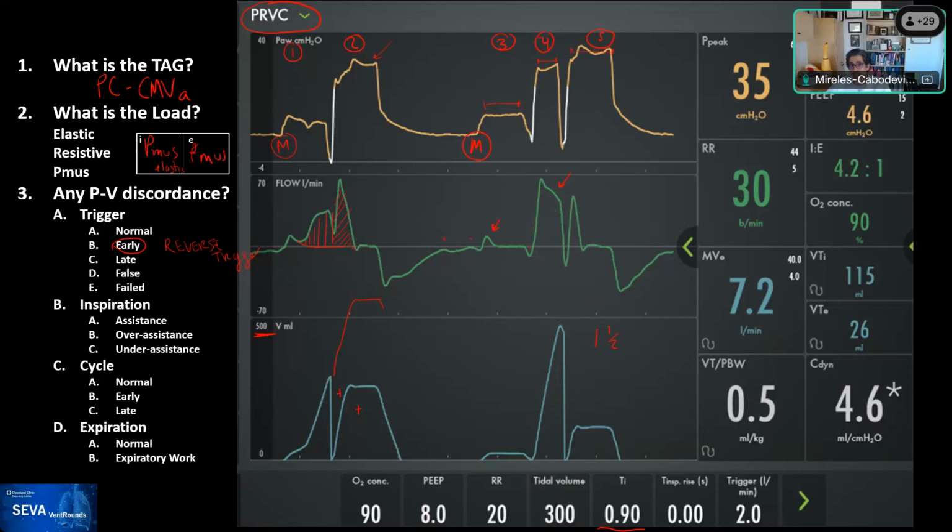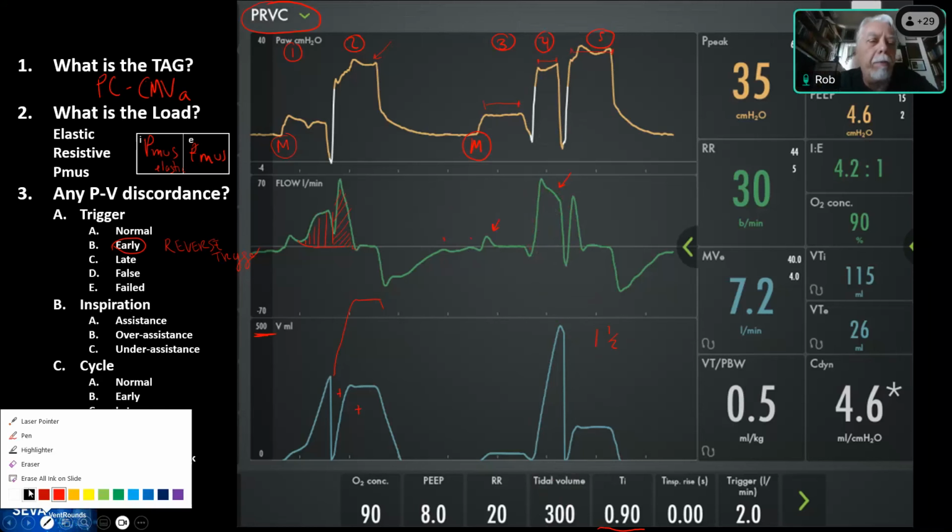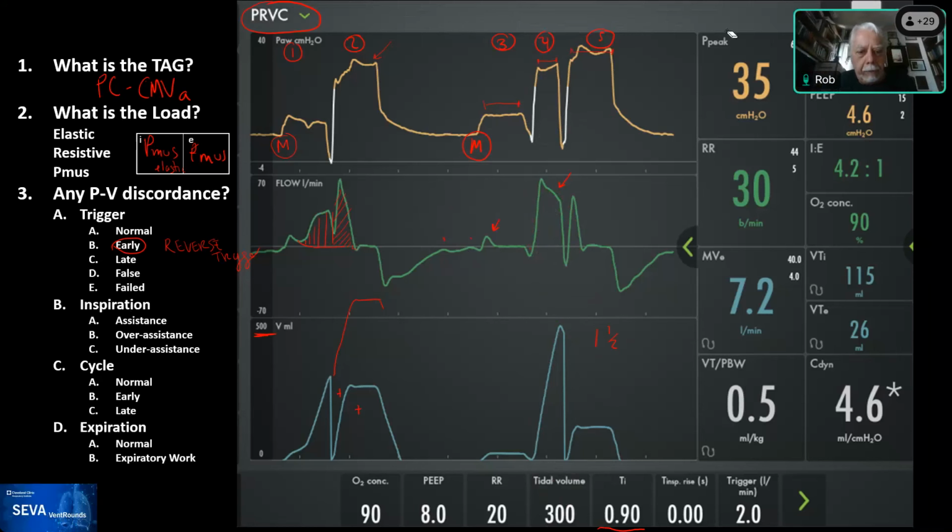So we figured this out one day when we were looking at this and saying, is this fake news? But then you can see it consistently. Yeah, we called the rep, the sales rep called the engineer, and they verified it, but we couldn't find it that day in the manual.